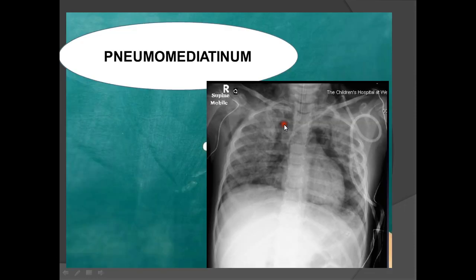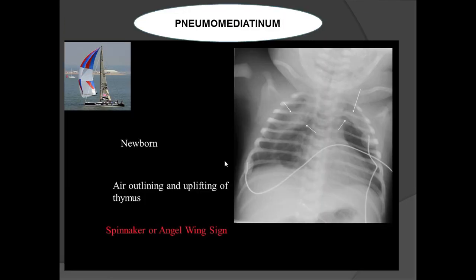Coming to pneumomediastinum: air is seen within the mediastinum as streaky lucencies on both sides, also tracking along the pericardium, into the neck region, and into the axilla. This is pneumomediastinum.